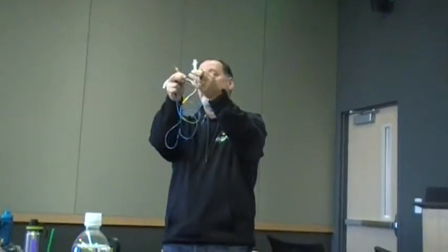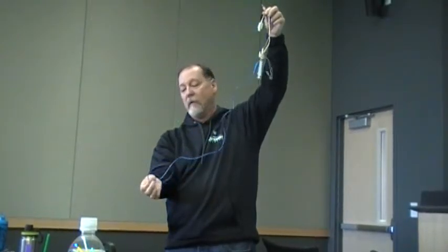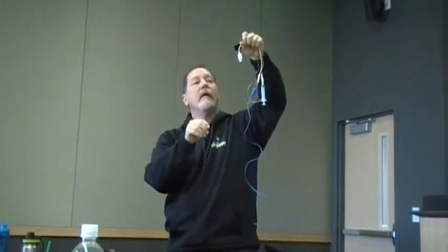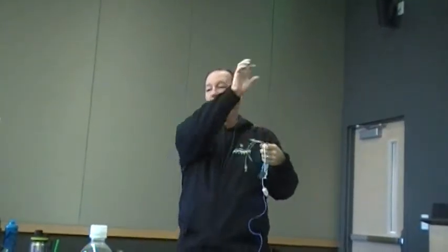So all of these catheters connect to holes and openings in the Swan-Ganz, that you can connect to a pressure manometer. And that manometer then reads out the pressure at these different ports.